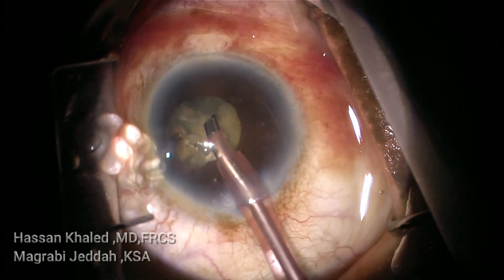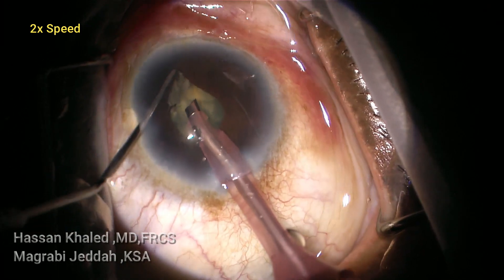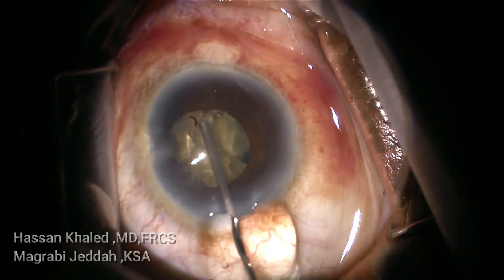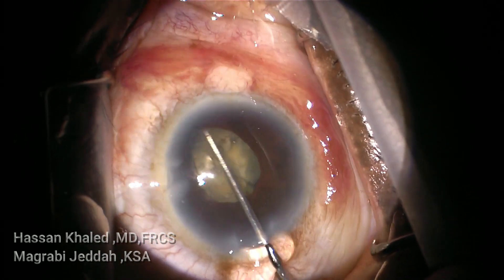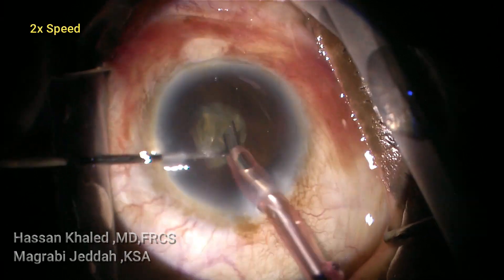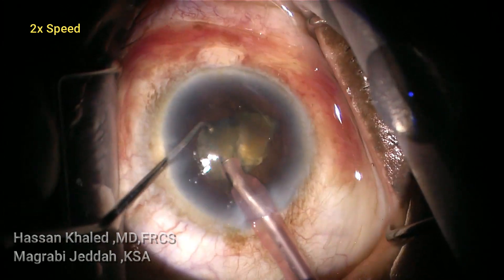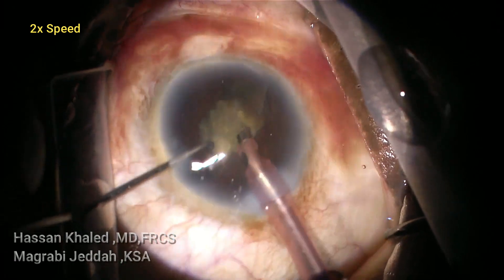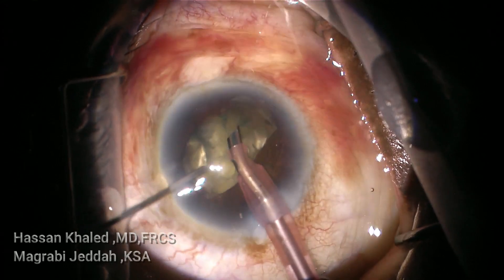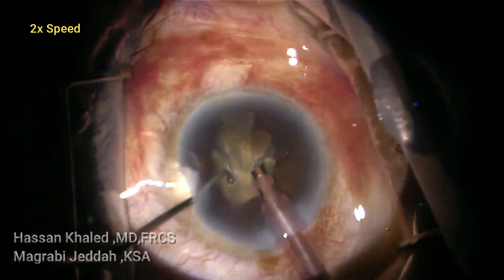Again injecting dispersive OVD through the side port and continuing to emulsify. You can see the pupil now at 2 millimeters in diameter. Injecting OVD to dilate the pupil and rotating the nucleus and continuing to emulsify these pieces. Again injecting OVD, you can see the pupil, and continuing emulsifying.